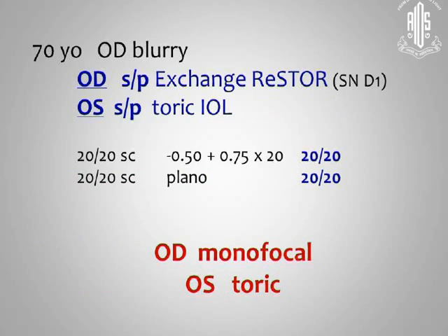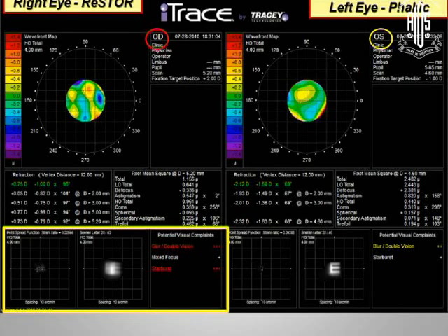He was actually able to avoid vitreous loss, put in a monofocal in the sulcus, and we in fact got 20/20. Now, yeah, I know, they started the timer wrong. So this is his pre-op.